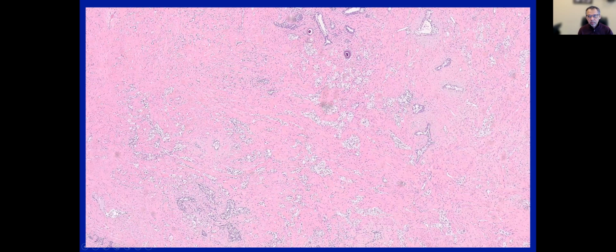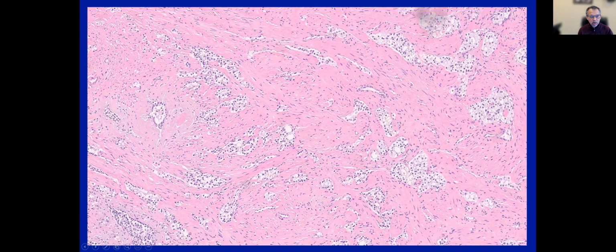And then when we look at the benign glands, there is also a clearing of the cytoplasm. But I think if you pay attention to the morphology here, the first thing that comes to mind is, oh, this is a high-grade prostate cancer. Maybe the correct grade would be 4 + 5 = 9 or grade group 5. And I think you can see here clearly numerous cords, single cells, nests, so perfect architecture for a higher grade pattern, grade group 5 prostate cancer.